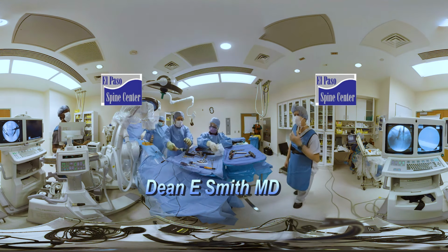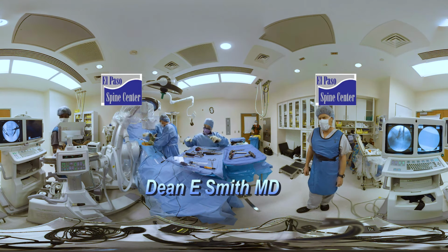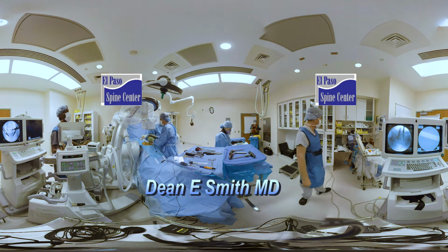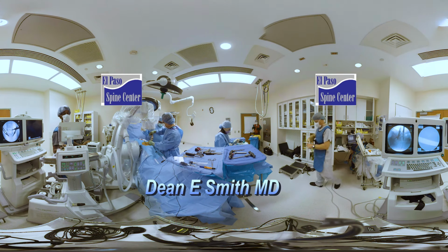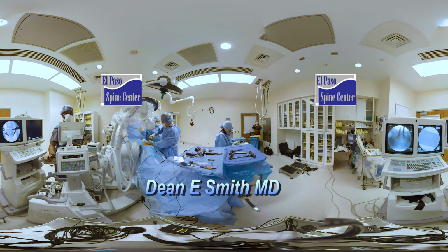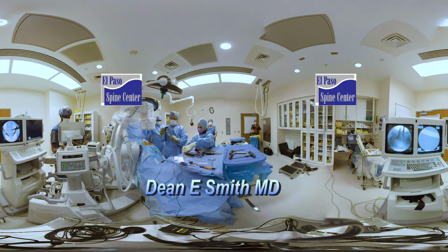Lateral. Alright, thank you. Okay, let's measure that. It looks like, I'm going to say 35, even though it's a little bit smaller. Okay. And you're loading the next screw. I like that.